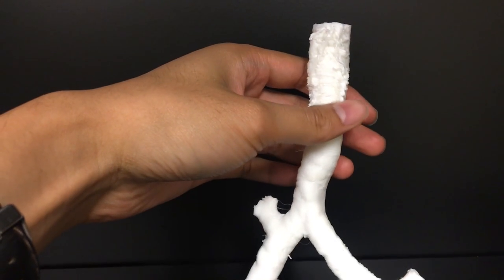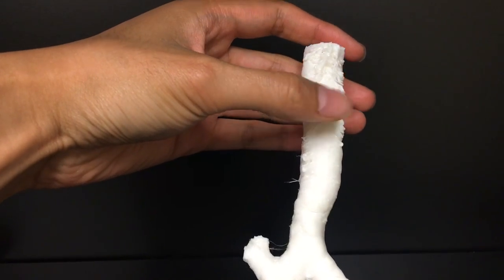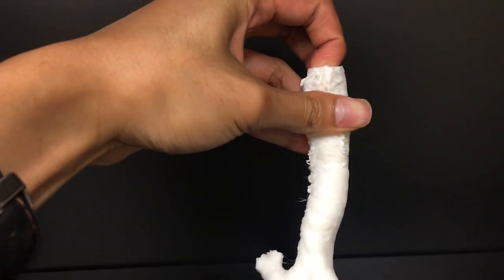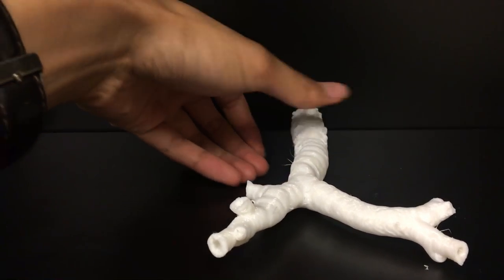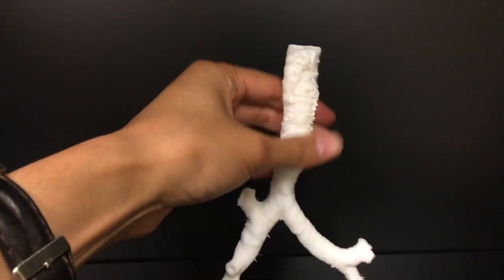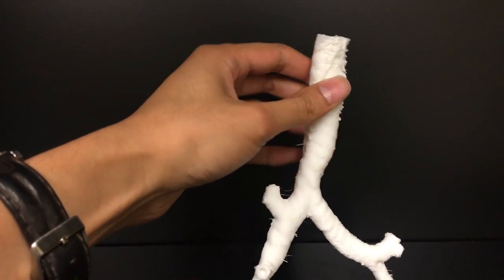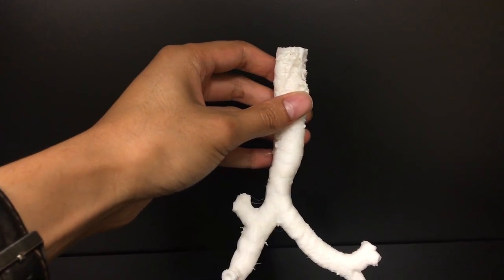It actually resembles an airway, and really, if we're just making a bronchoscopy simulator, we're not totally married to the surface quality of this, since you're not going to see it normally. And then lastly, the test is whether or not we can actually put down a double lumen tube into this model. So if I had made this model out of a hard thermoplastic like the PLA that I showed from earlier, there's no way that I could possibly fit a double lumen tube down this airway without expanding it to a comically large degree, because the double lumen tube is pretty large.